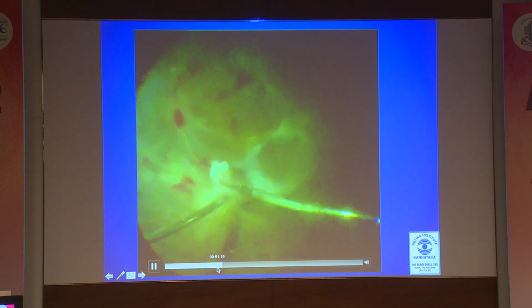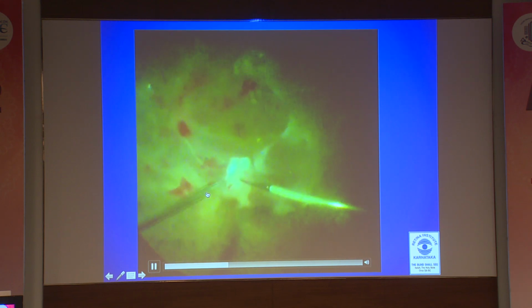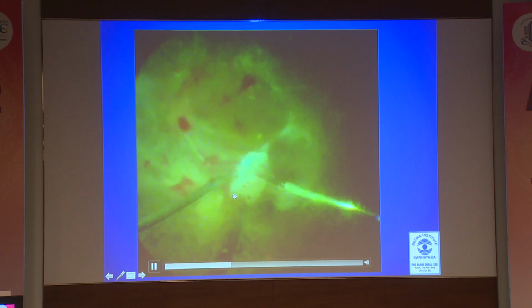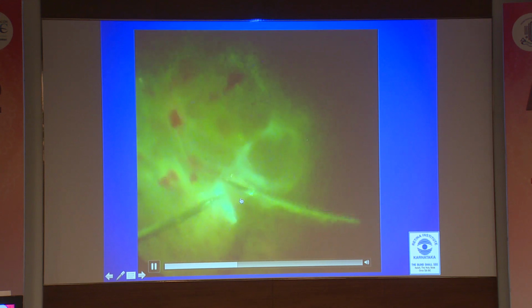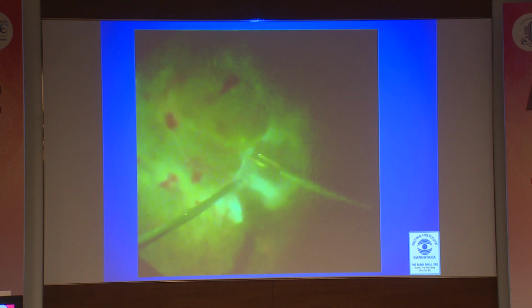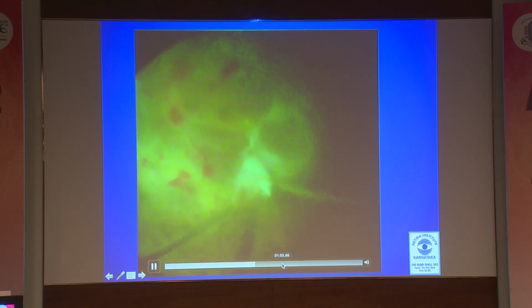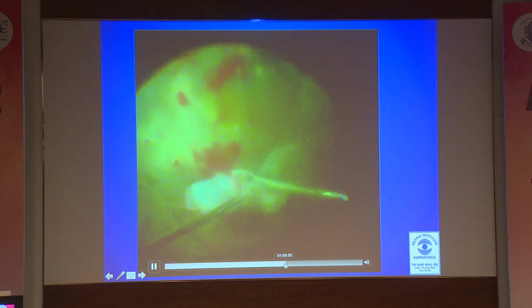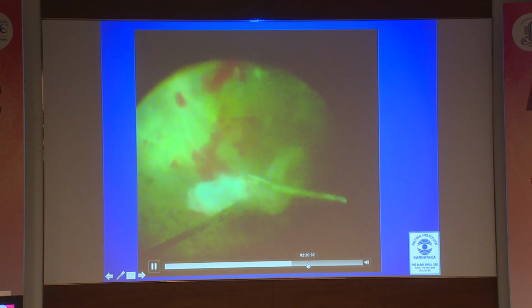And it's extremely helpful for hemostasis, because normally what happens is, by the time you change the instrument and bring the diathermy, the blood clot would have become more diffuse, and you're unable to identify from where it is bleeding. And I find that bimanual surgery using the suction and the diathermy tip allows me to coagulate the bleeder very, very efficiently, without damaging more of the retina. So bimanual surgery is what I prefer in tough situations whenever there is a mobile retina, and that's what we are continuing here. So with that, we continue bimanual dissection, and hemostasis is achieved.